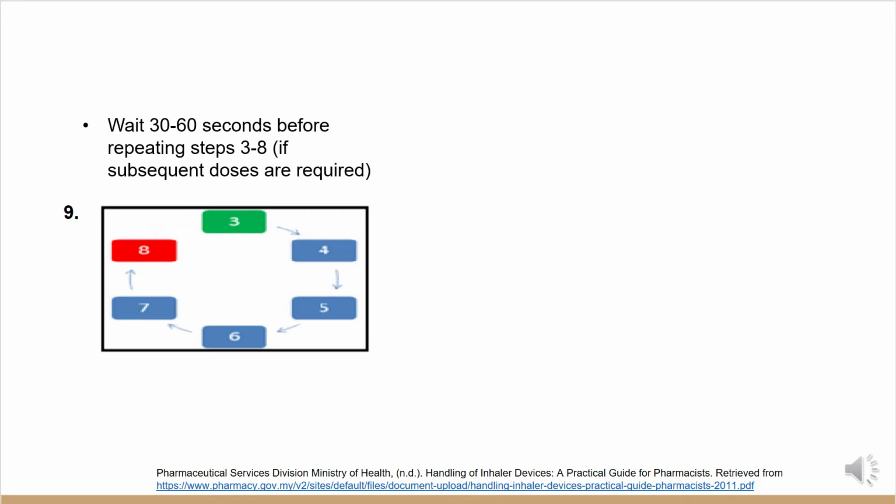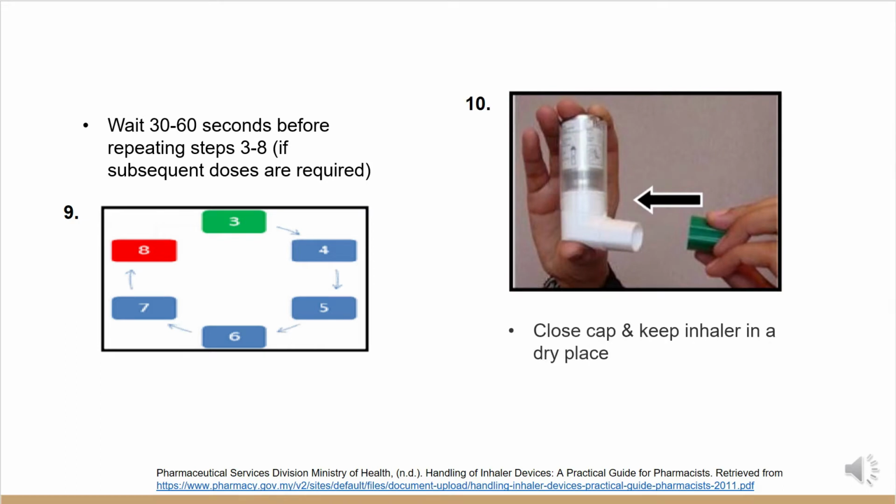After that, they need to wait 30 to 60 seconds before repeating steps 3 to 8, and this is only done if subsequent doses are required. Last but not least, they need to close the cap and keep the inhaler in a dry place.